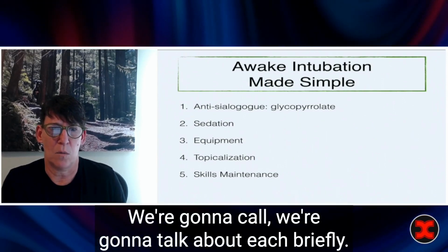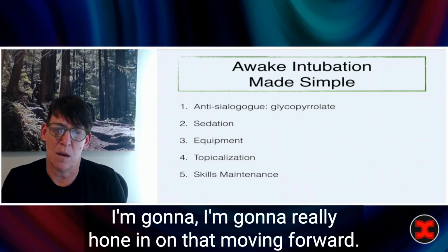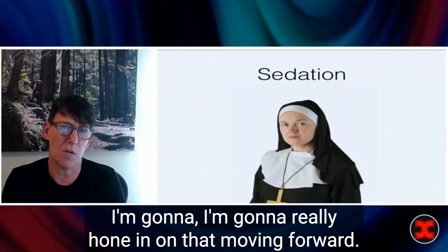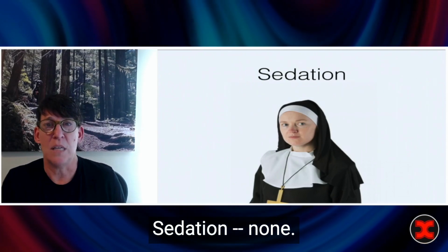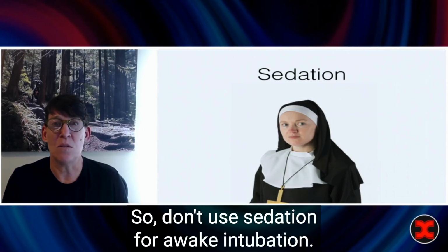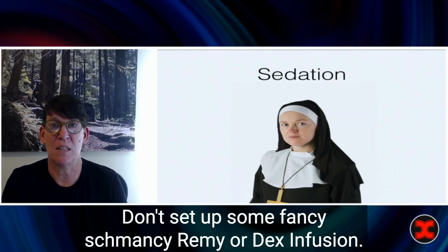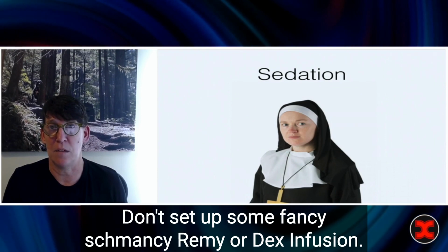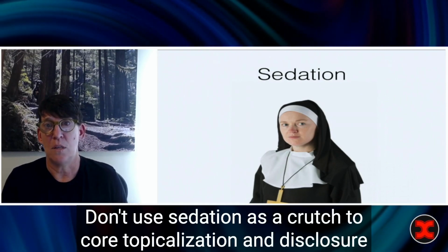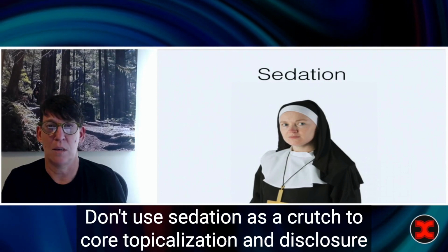Sedation, we're going to talk about briefly. Equipment and topicalization, I'm going to really hone in on that moving forward. Sedation: none. Just see what I did there. So don't use sedation for awake intubation. Don't set up some fancy schmancy remifentanil or dexmedetomidine infusion. Don't use sedation as a crutch to poor topicalization.